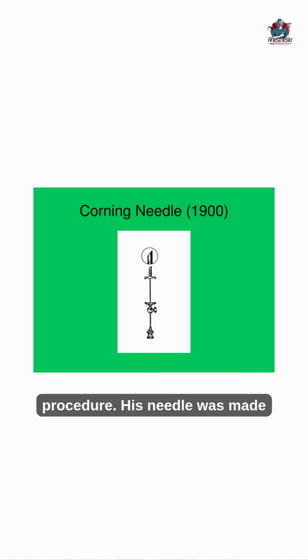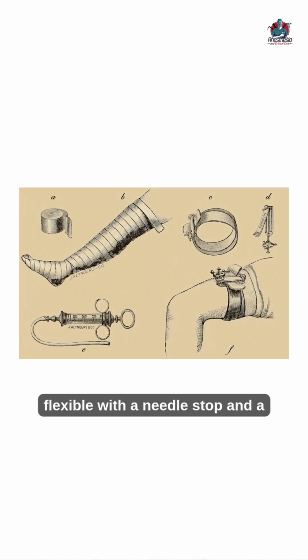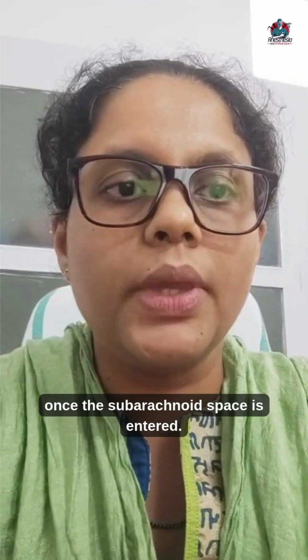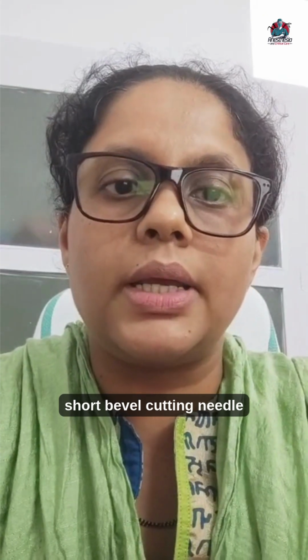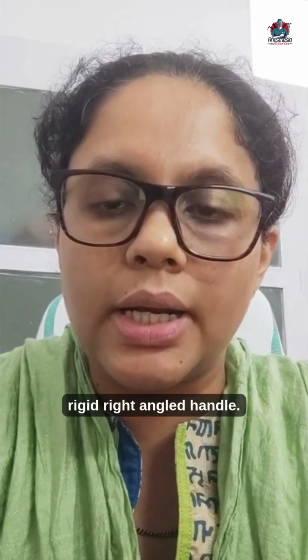His needle was made of gold and platina, and the cannula was flexible with a needle stop and a set screw to fix the needle at the correct depth once the subarachnoid space is entered. It was a sharp, short bevel cutting needle, and the introducer was short with a rigid right-angled handle.